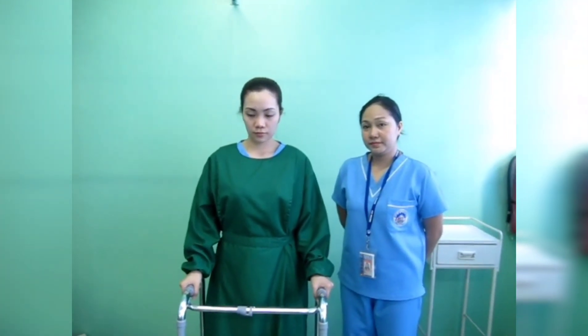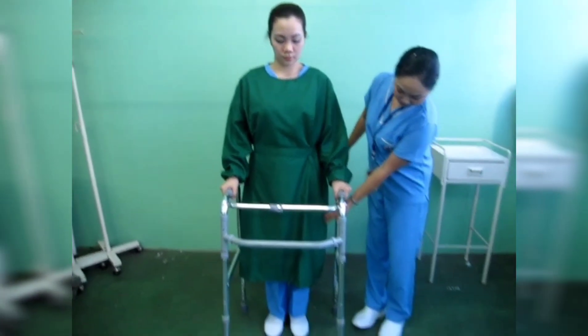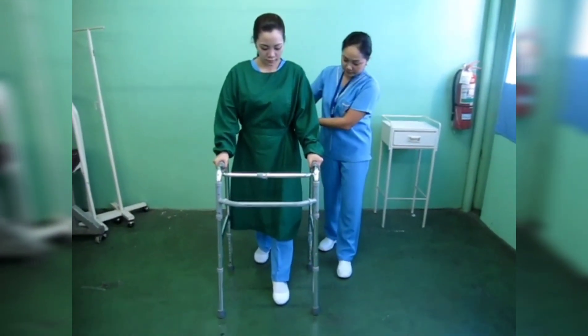Second procedure: if one leg is weaker than the other, move the walker and the weak leg ahead together about 15 cm or 6 inches, bearing weight accordingly.